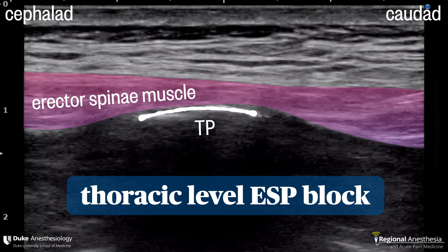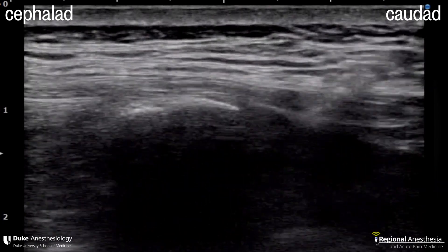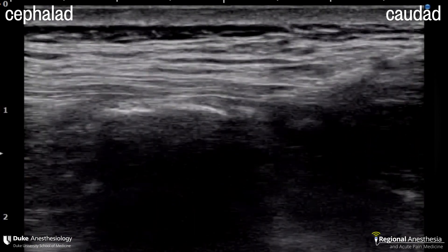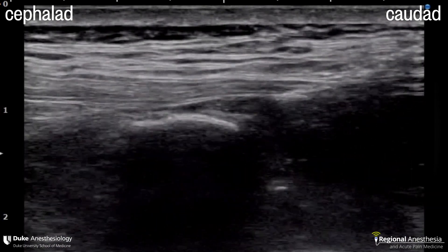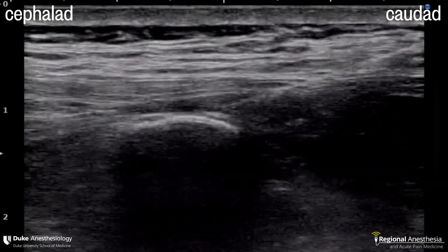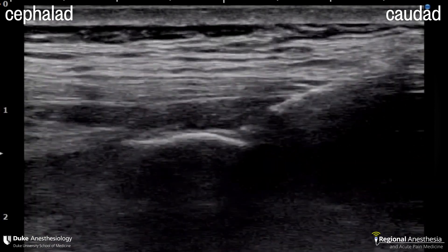Here's what it looks like in the thoracic region. We see the squared-off transverse process and the ES muscle just superficial to that. Depending on the level you're at, you may also see trapezius and rhomboid muscles, but these are less important to identify. The needle is approaching from the caudal aspect and aims to contact the corner of the TP. A test injection shows the fascia of the ES muscle beginning to lift up, and now it's a matter of hydrodissecting with your injectate until you see the whole muscle lifting off the transverse process. At the end, you should see a broad stripe of local anesthetic across the screen separating the TP from the muscle.